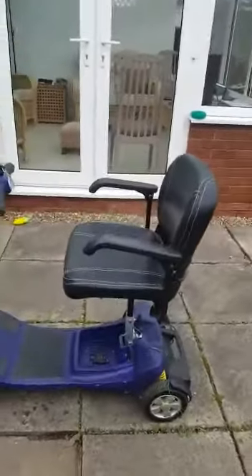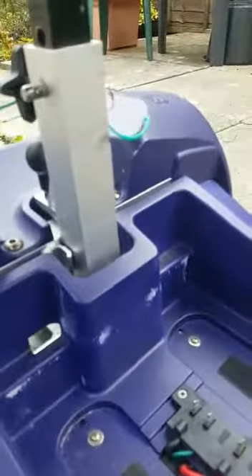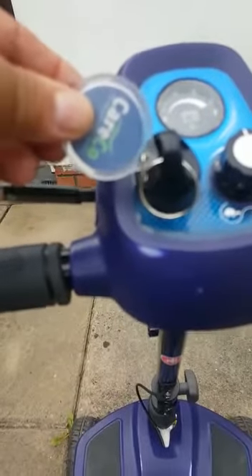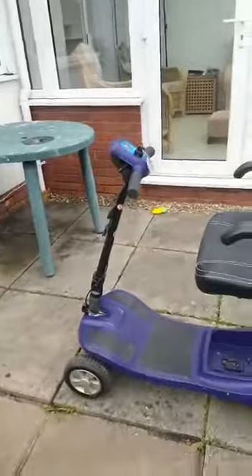First of all, aesthetically, if you look at this paintwork, it's chipped and scuffed — and this is from everyday use. The act of removing the battery has caused the paintwork to scuff, and also if you notice, you've got the Careco key fob, and the action of that rubbing back and forth has caused the scooter to scuff as well. So aesthetically, the scooter is really not fit for purpose.